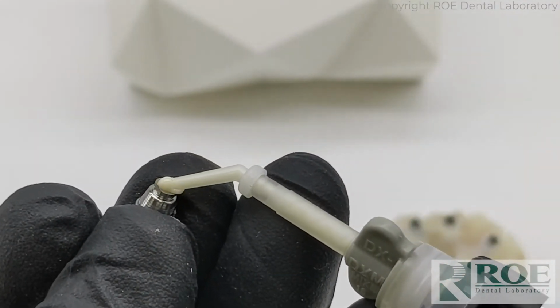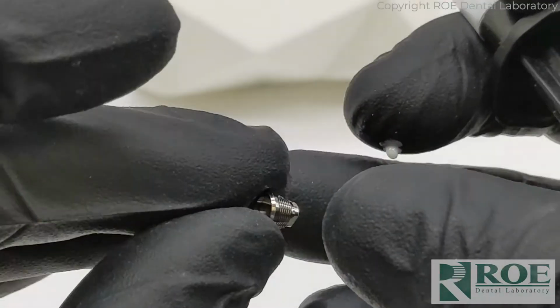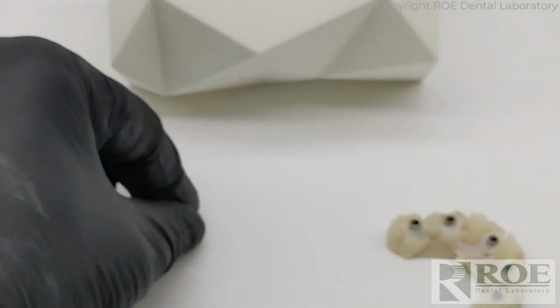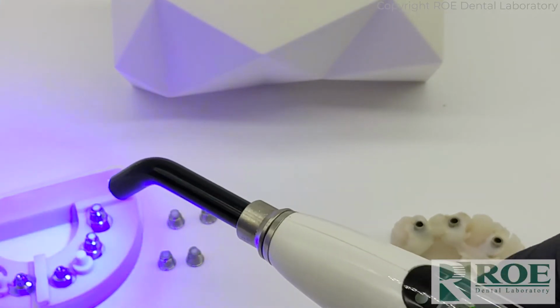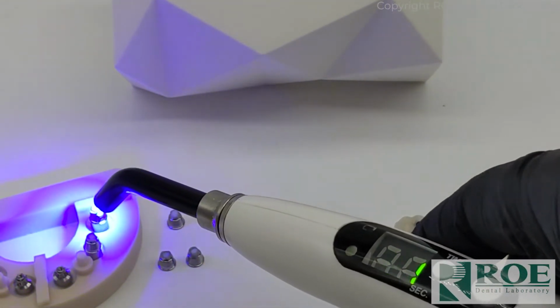What you don't want, I'll show you here, just a dab. What you don't want is to penetrate the inside, because then it can interfere with seating. Just block them all out. And because Stellar is a dual cure, I'm just going to go ahead and cure them in.